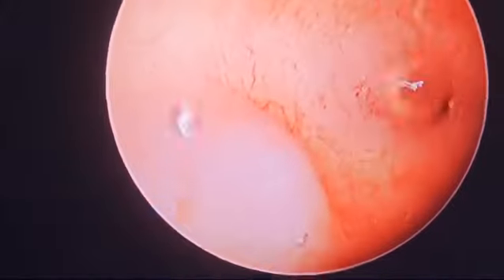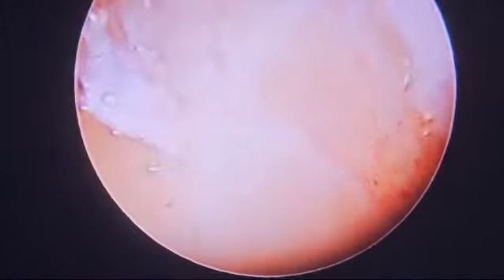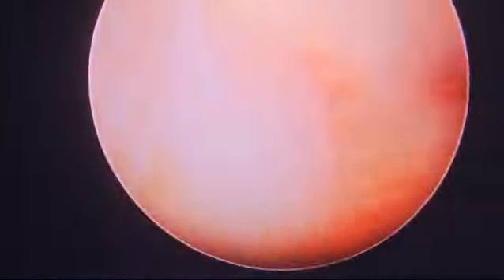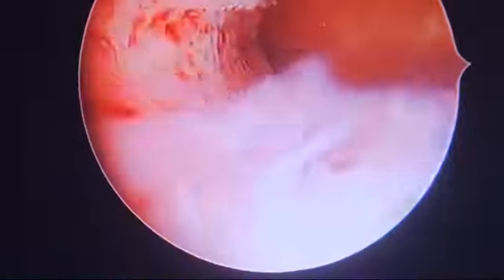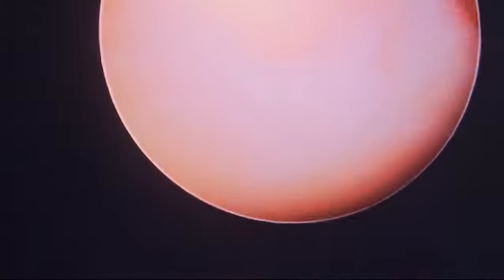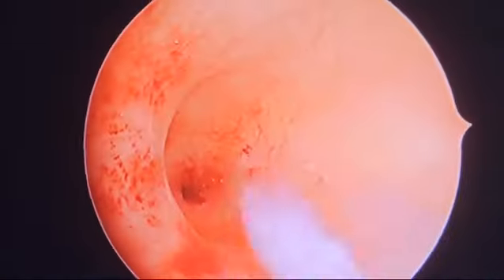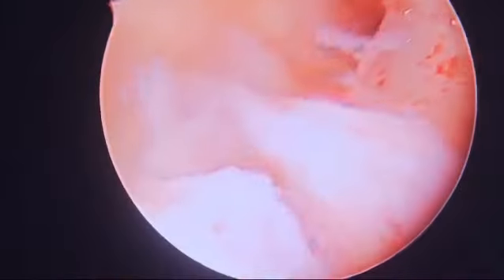Left tube — yes, the bubbles are going in. So we have restored the tubal patency with the help of the procedure known as tubal cannulation. There are features of chronic endometritis as well. We are sending greetings from Hamdard IJIB Center, Srinagar, Kashmir. May God bless us all.